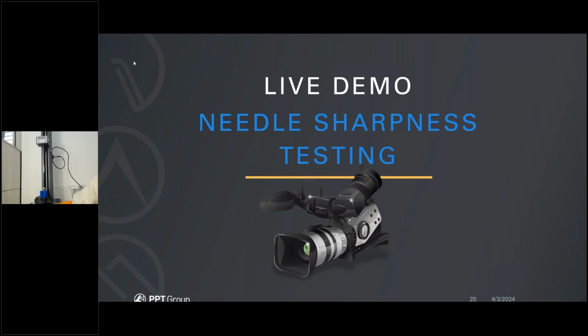What I'm doing here is simply using the wheel to bring the crosshead all the way down to a point where it's close enough to the fixture. And here we go. There are some alignment issues that need to be taken care of. The first thing I'll do is insert our needle, screw it in place. There it is. Then I'm going to move right there to the center of the cap and tighten everything down. That's pretty much all there is to it. That is our test setup now. We'll tighten the load cell, make sure there's no movement. And now the test is ready to go.